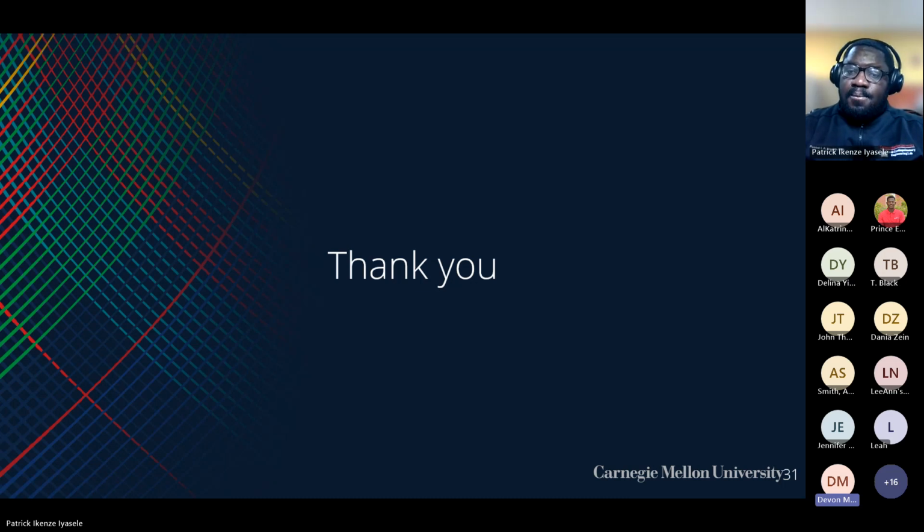I will start off. Patrick, could you tell us why sheep are used instead of any other test animal or test subject? Well, sheep are mostly used because, one, they're easy to work with. They're very calm animals. But it's really the size of the animals that we're concerned about, to try to transfer the capability of our devices to humans. The sheep that we're working with are not small sheep. We're working with 150, 160 pounds. I've worked with a 220-pound sheep. So these are large animals, so that when we transfer the device from animals to humans, the body size is the same.